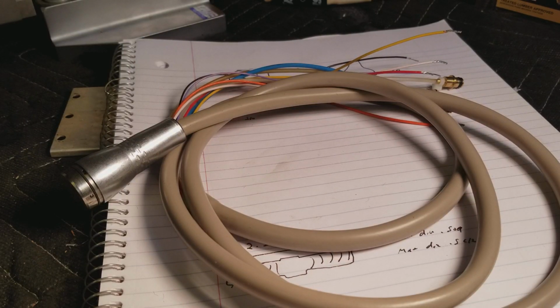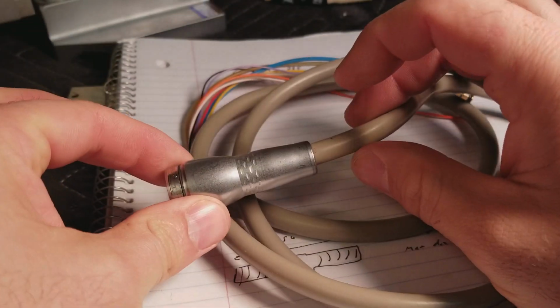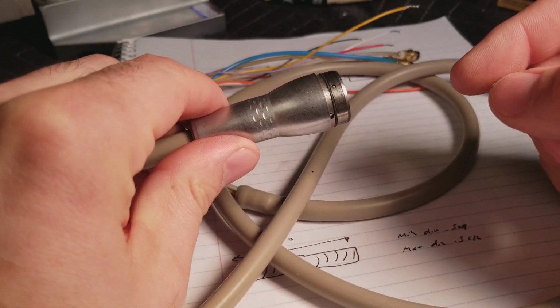I was running into a little problem with my A-dec electric handpiece and searched around and couldn't find much on how to fix the actual problem. Anyway, so this video is just to talk a little bit about testing your A-dec VE-9 cable, which is this piece here that hooks off your 500 delivery system unit, which controls your electric motors.